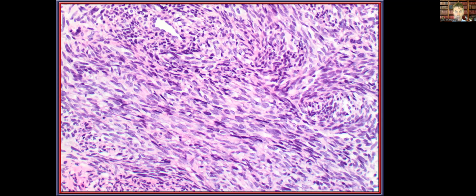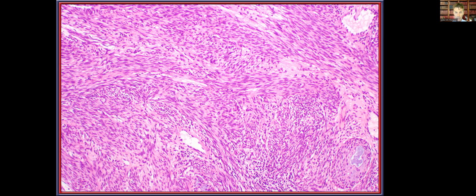It is often quite monotonous in its overall appearance, not much in the way of pleomorphism. And so again, whenever I have fusion-associated tumors, they tend to be much more monotonous than those that are driven by a wide diversity of various molecular pathways involved.